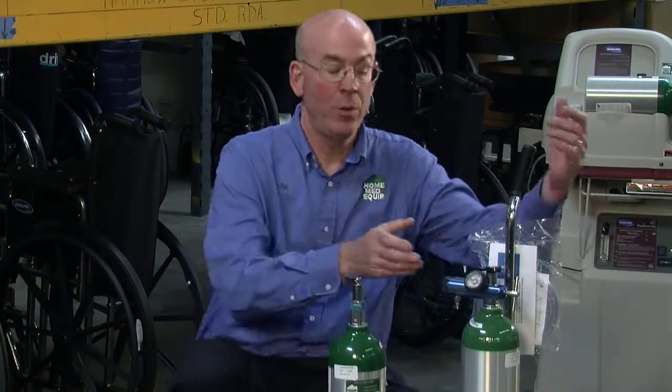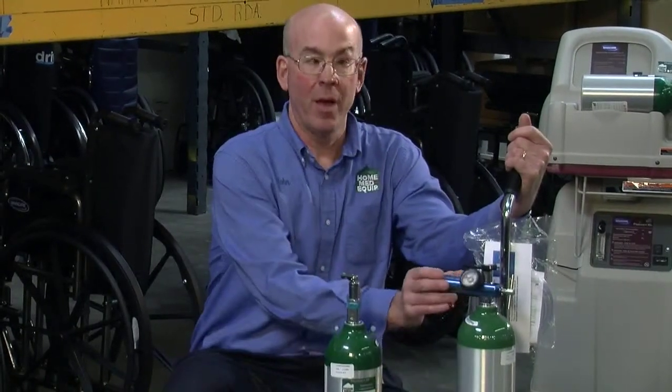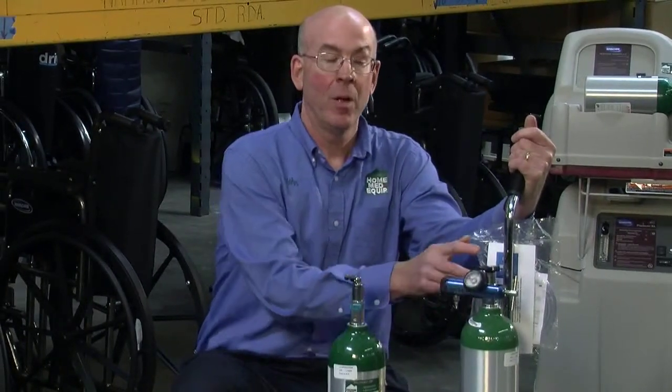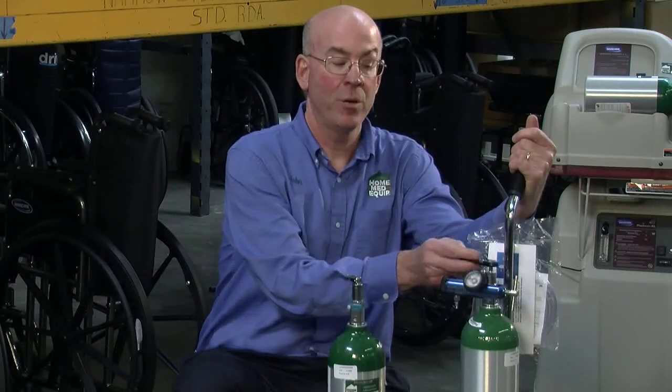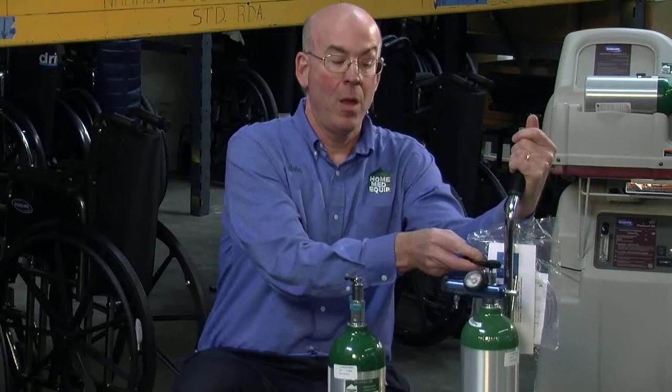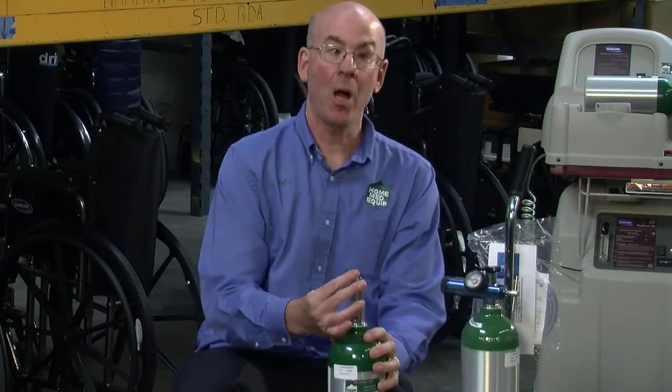There are basic components to this system which include the oxygen cylinder, the oxygen regulator, and the wrench to turn on the oxygen cylinder. Some oxygen cylinders have a built-in toggle which also acts as the wrench.